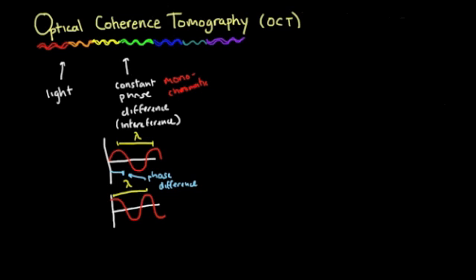So I want to draw just a couple extreme examples. And interference is just the summation, the adding of light waves. So here's a situation where we have two light waves. I just drew them in different colors, but they have the same wavelength. Just wanted you to be able to see that there are two waves, and if we were to interfere these, well, the peaks match the peaks, the valleys match the valleys.